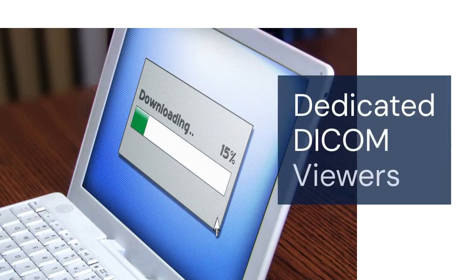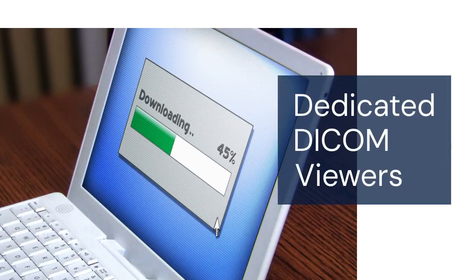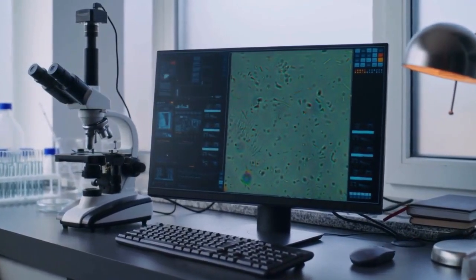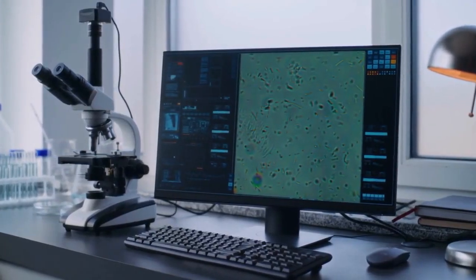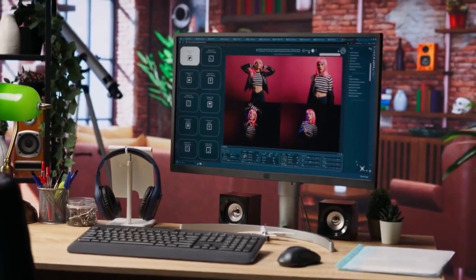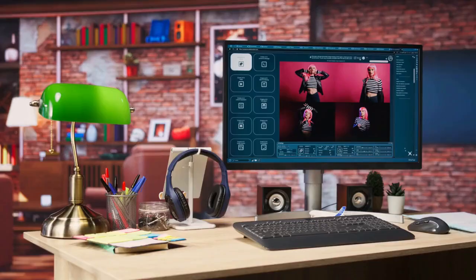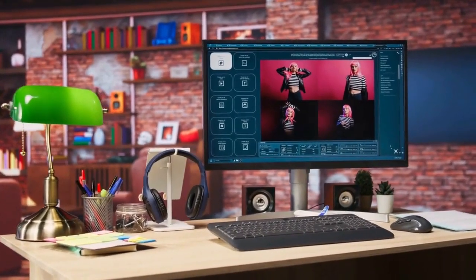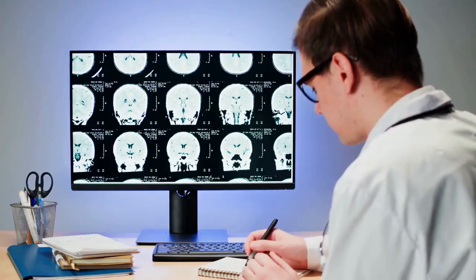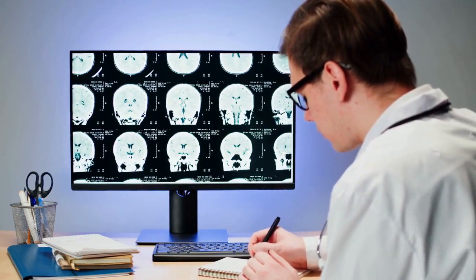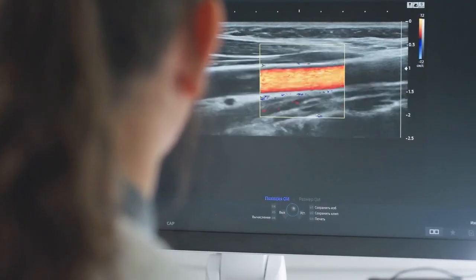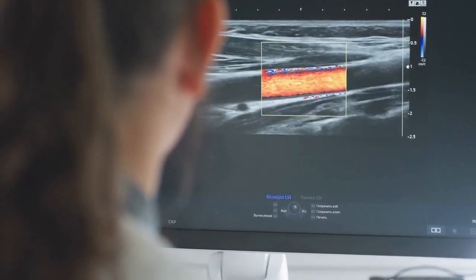First, let's explore dedicated DICOM viewers. These are specifically designed for opening and viewing these types of images. A popular choice is Radiant DICOM Viewer. It's free for personal use and offers a user-friendly interface. Simply download the software from the Radiant website and install it following the on-screen instructions. Once installed, open the program and click File, then Open. Navigate to the location of your DCM file and select it. Radiant will then display the image and is excellent for viewing, zooming, and even making basic measurements.